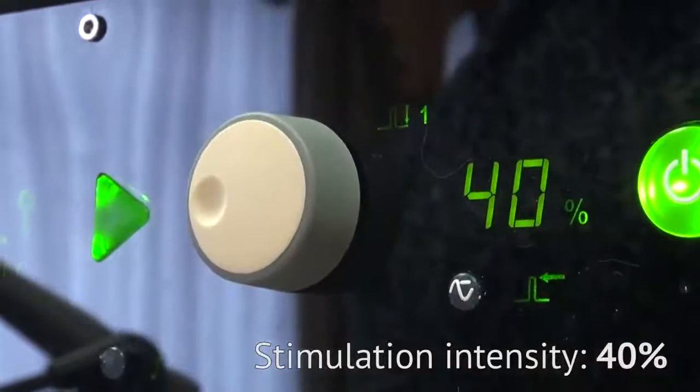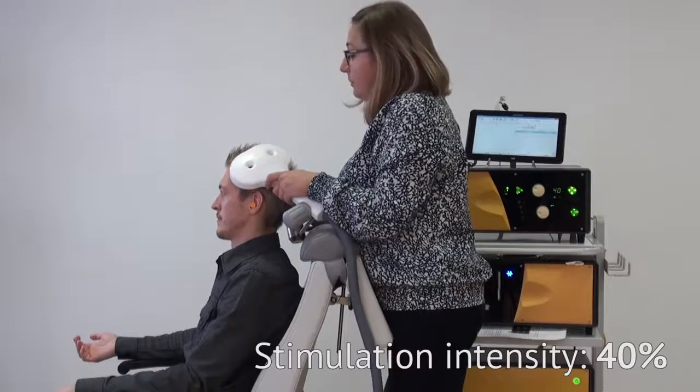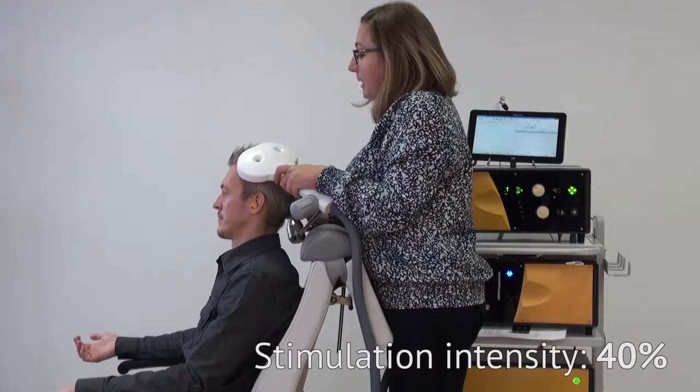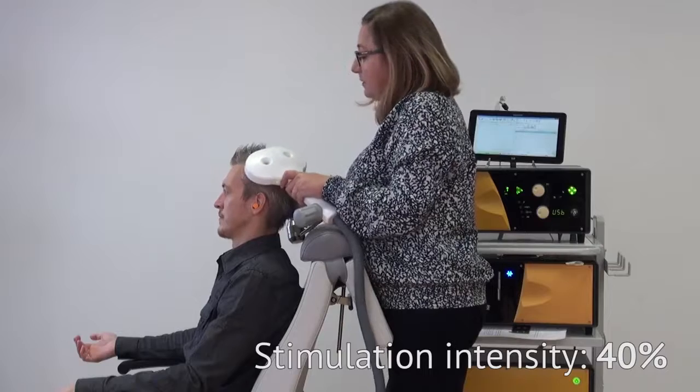And repeat. Pulse, observe, movement, pulse, observe, movement.